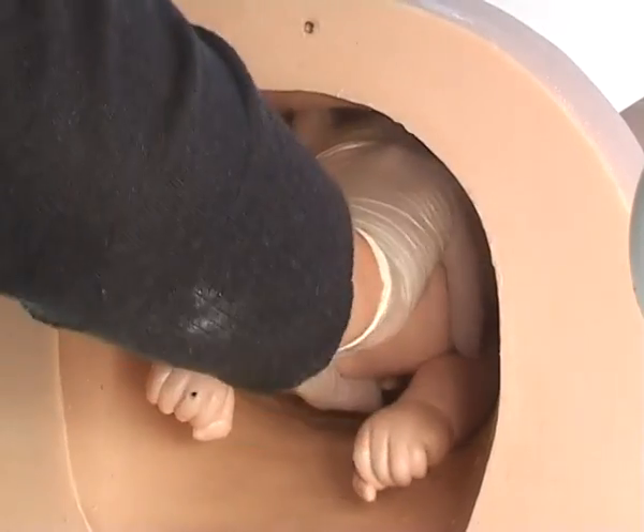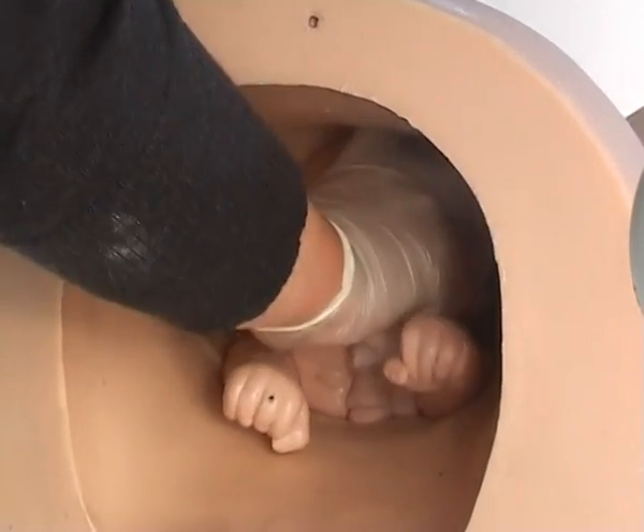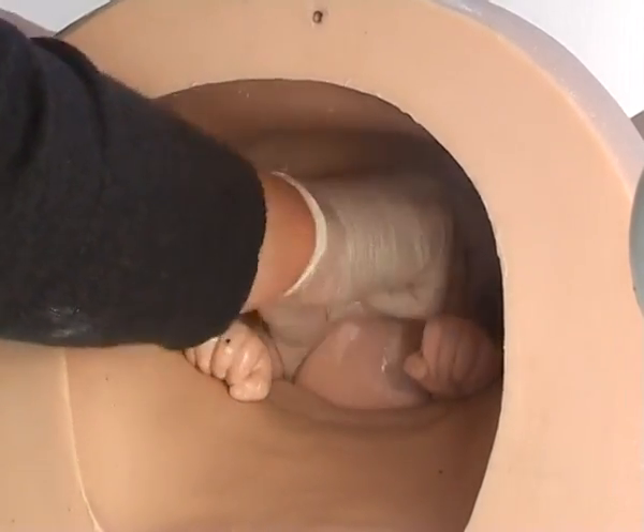Try to get the head through the pelvic brim in the transverse position before swinging the head to the midline. Now push on her head to continue her progress.